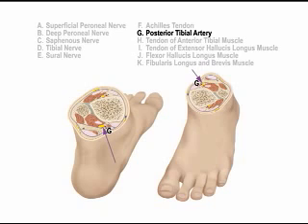If a nerve stimulator is used to identify the tibial nerve at the ankle, 5 to 7 milliliters of 0.75% or 0.5% ropivacaine or 0.5% bupivacaine can be injected on each of the 5 nerves. It is very important to remember that epinephrine addition to the local anesthetic agent is absolutely contraindicated when doing an ankle block, since this can seriously threaten the integrity of the blood supply to the foot.